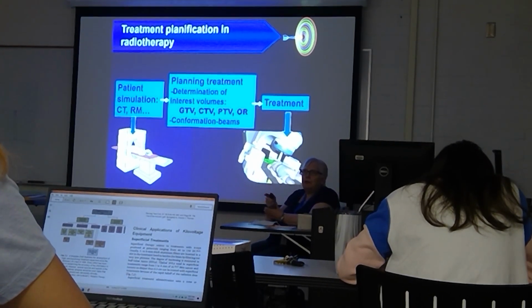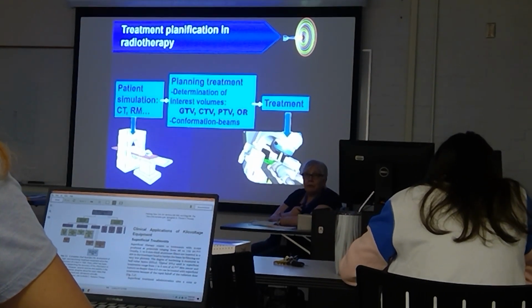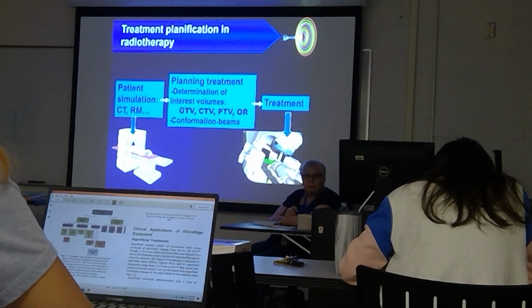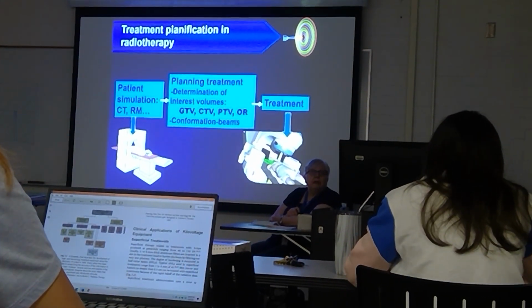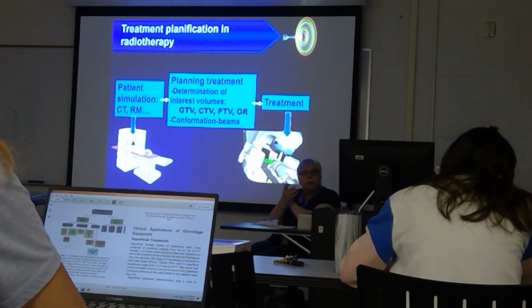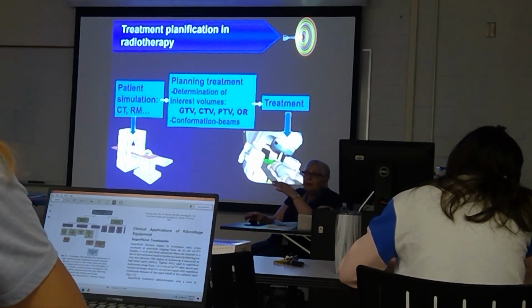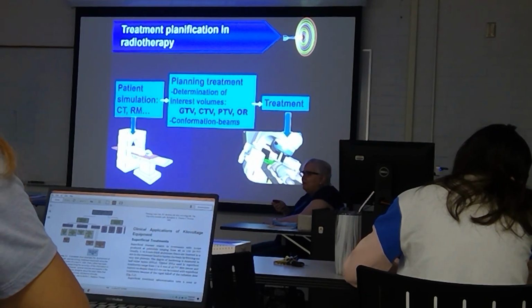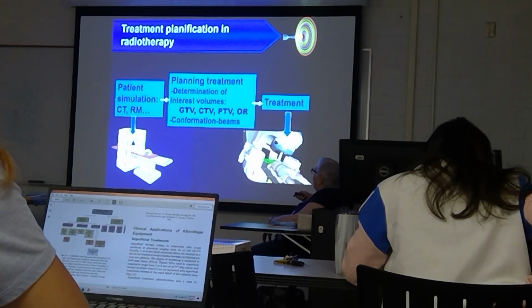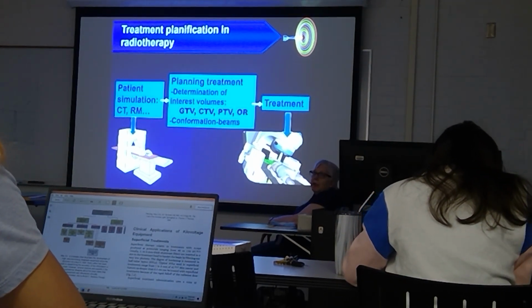What's the problem if you didn't realize that they were done feet first and you treated them head first? Everything would be reversed, right? So you'd be treating the wrong side. You'd be shielding the wrong area. Normally, you would treat head first unless told otherwise.